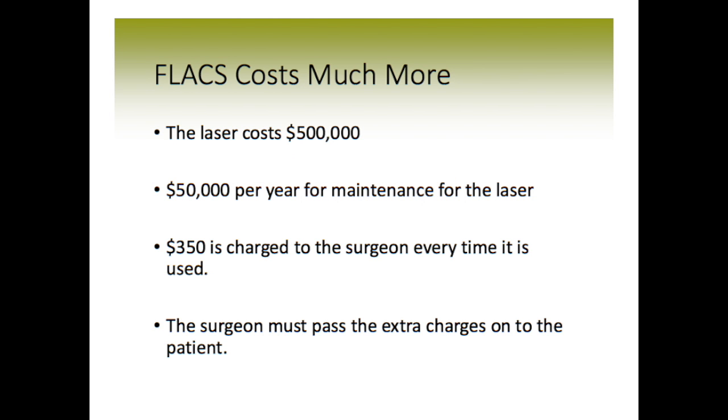And then there's the cost of FLACS. The laser costs $500,000, approximately $50,000 a year for maintenance of the laser, and about a $350 charge to the surgeon every time it is used for each eye. And the surgeon has to pass the extra charges on to the patient.